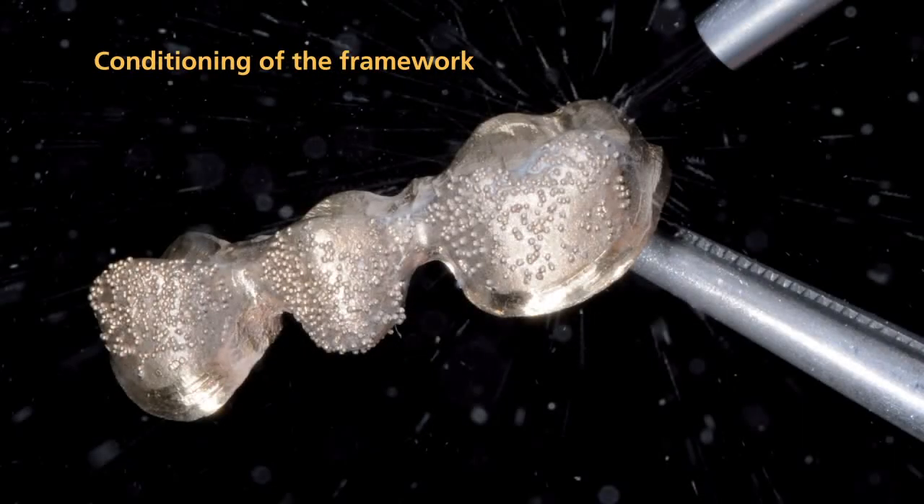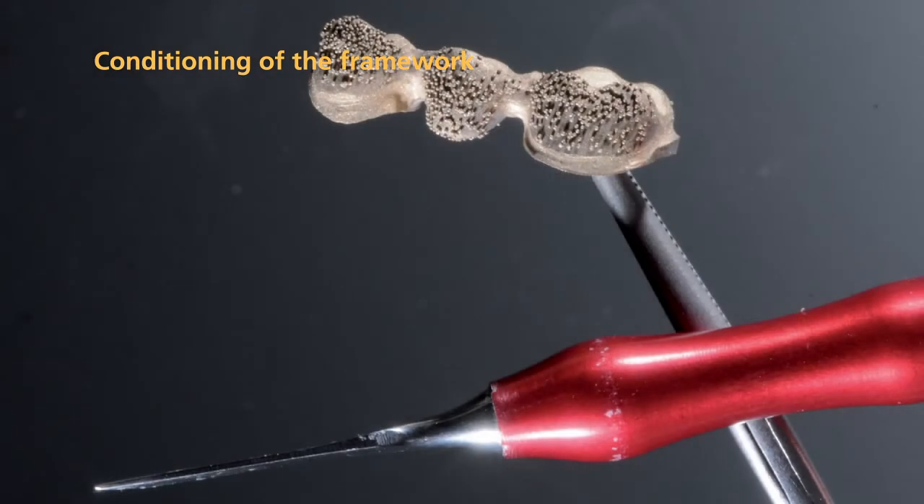When you fabricate a metal supported restoration, it is particularly important that you condition the framework appropriately before you apply the veneering material. Carefully blast the framework with aluminum oxide of a grit size between 80 and 100 microns using a pressure of 2 to 3 bar.